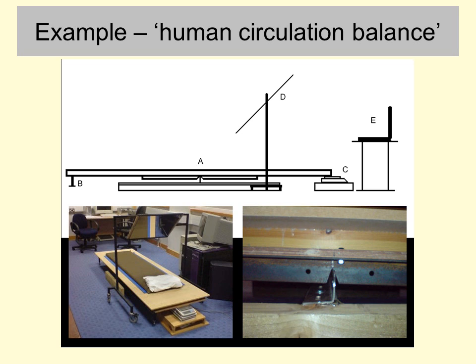And the question we wanted to ask with this is whether we could detect a change in the total volume of blood in the brain that was related to information processing. So that's a different question from what fMRI measures, because fMRI is mainly sensitive to regional redistribution of blood flow from one part of the brain to another.